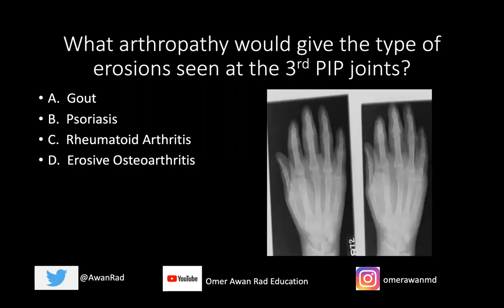The question I have for you is: what arthropathy would give the type of erosion seen at the third PIP joints in the hands here? Would it be gout, psoriasis, rheumatoid arthritis, or erosive OA? And of course, the answer here is gout.